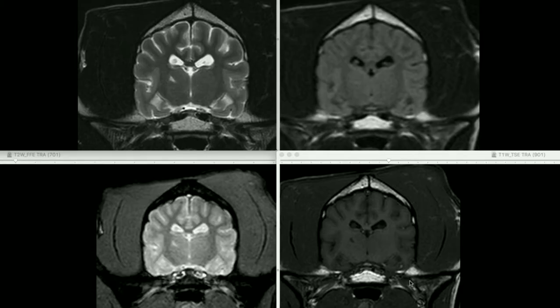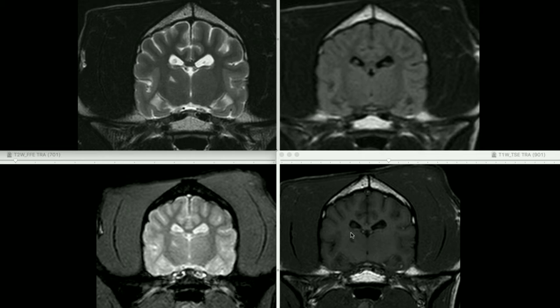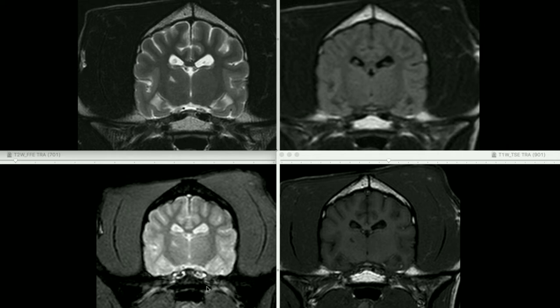On MRI it's very important to compare the different pulse sequences, as the different signal characteristics give us a lot of information about the etiology of the pathology. Looking at the right thalamic lesion, it is high signal on T2 but very low signal on T1, and we don't really see it on the FLAIR sequence, which would suggest it is partly cystic. On the T2 star gradient echo sequence, which we use primarily for looking for intracranial hemorrhage, we don't see any susceptibility artifact or signal void to indicate brain hemorrhage.